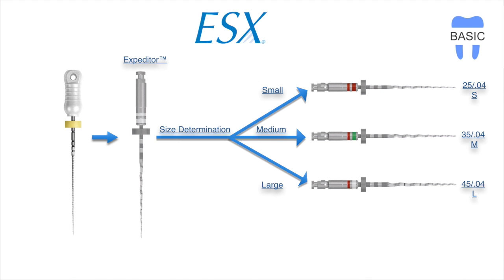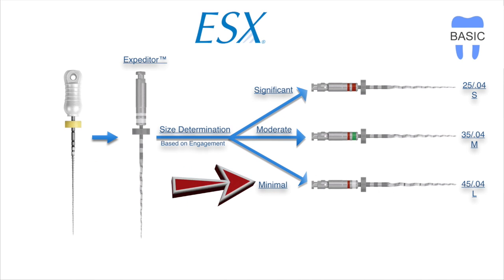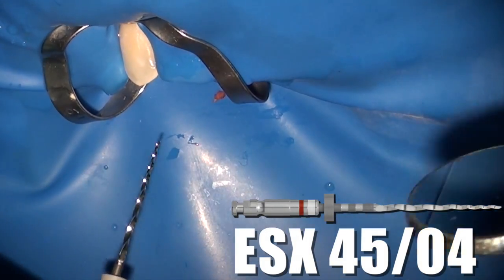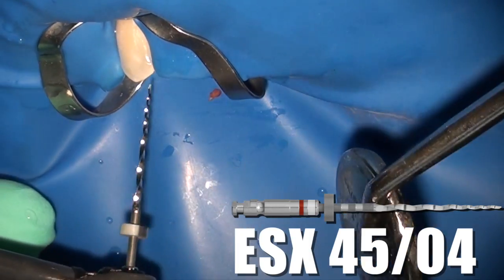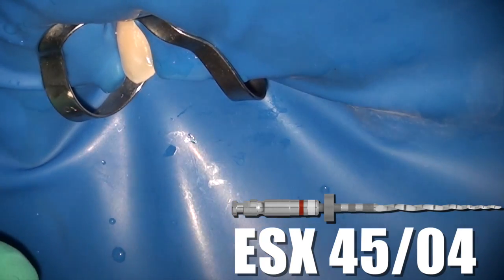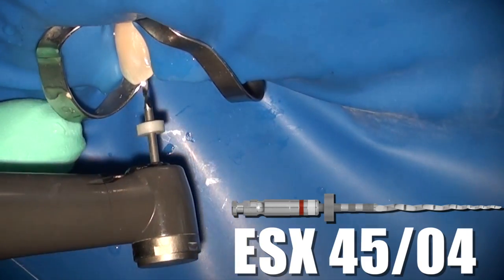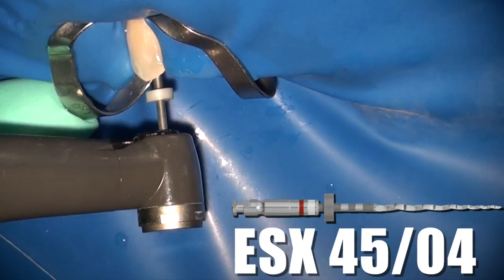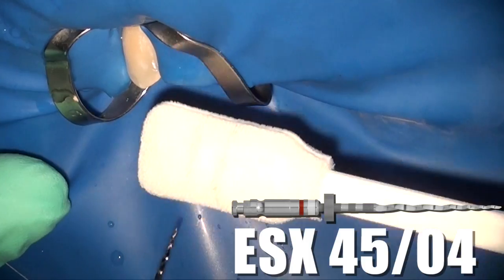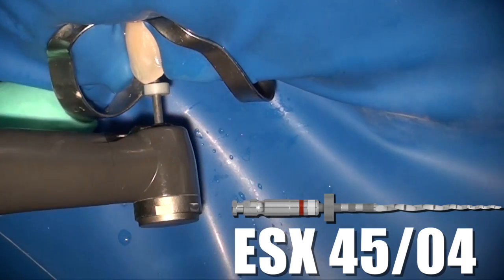The expediter reached the apex fairly easily with minimal engagement, so we're going to use a size 45 ESX as our master file. Once again, a few millimeters from the apex there's a slight ledge. If we orient the file tip toward the buccal it will engage that ledge, so we orient the file tip a little more toward the lingual to stay away from it. The ledge is caused by the resorptive lesion — it wasn't caused by the instrumentation, just the same resorptive lesion apparent on the x-ray.